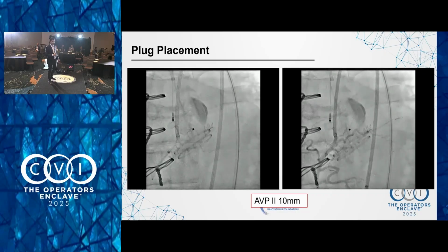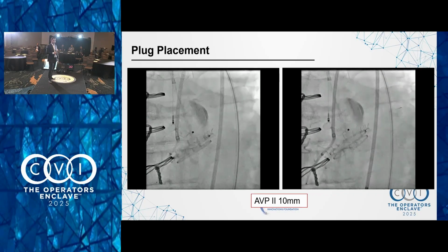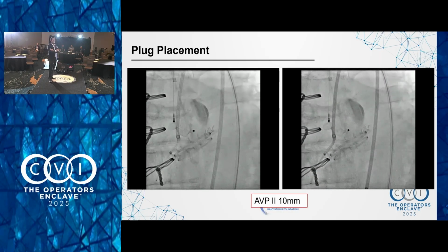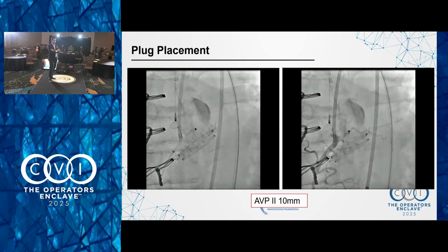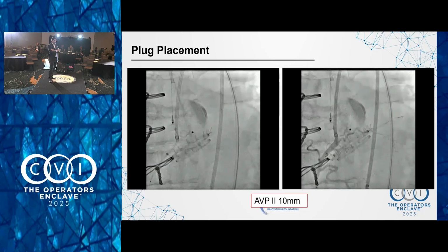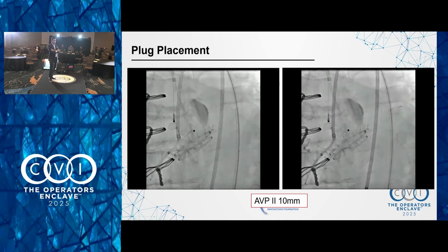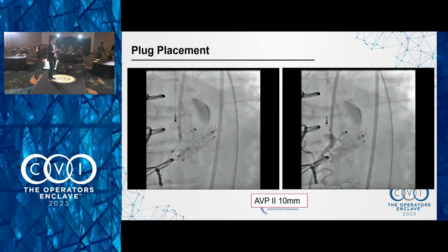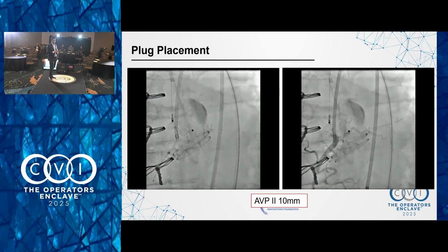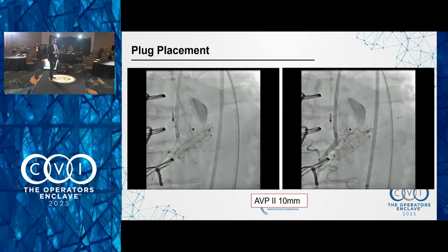It's kind of back in the aorta, right? It's not really sitting in the ostium, right? For the AVP, the proximal disc. Yeah, so my plan of deployment was the middle disc squeezed at the ostium of the pseudoaneurysm, letting my proximal disc overhang in the aorta so I don't create a closure in the RCA with that disc, and my distal disc will be inside the pseudoaneurysm. So you're keeping the disc away from the ostium of the right coronary. Exactly, because of the risk of thrombus.